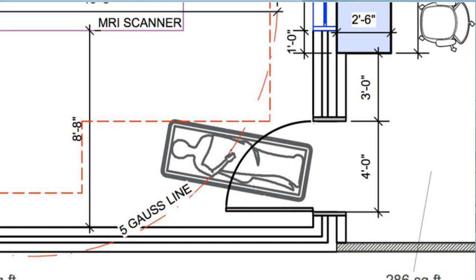We actually, in this drawing, extend it 3 feet up on this plan to push the operator's console at least 3 feet or a meter away from the corner of the opening where we're going to put the ferromagnetic detector. Just like we don't want the detector alerting or alarming on the door, we also don't want it alerting or alarming on the motion of the chair that the tech sits in, or the fact that they're using a stapler to staple some documents together, or they're picking up the handset to the telephone. We don't want those spurious alarms.